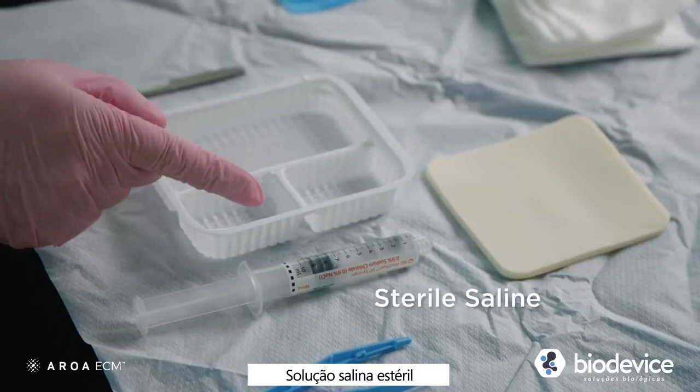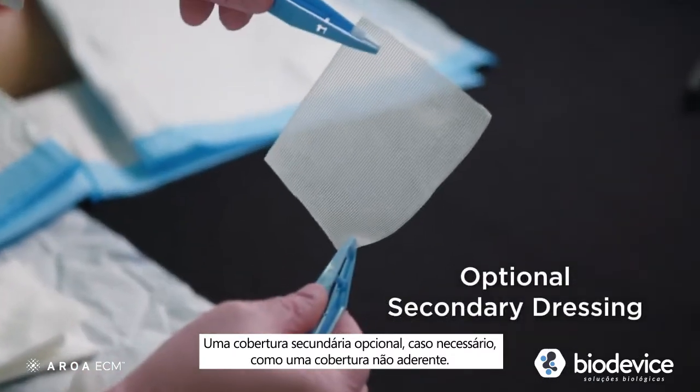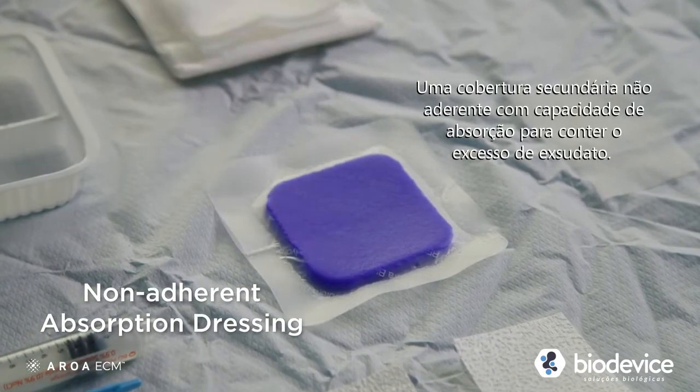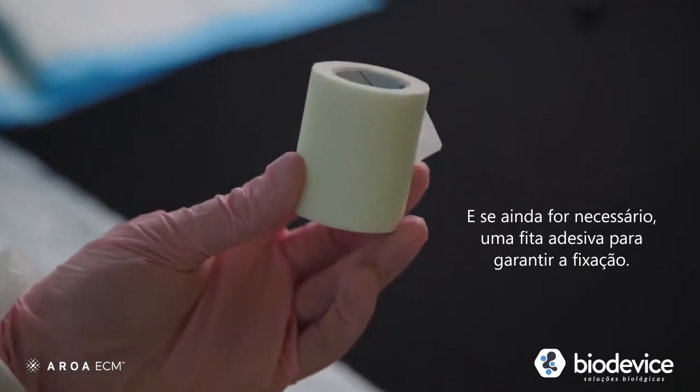Sterile saline. An optional secondary dressing if needed, such as a contact layer. A non-adherent absorption dressing that is appropriate to manage wound exudate. Something to secure the cover dressing with.